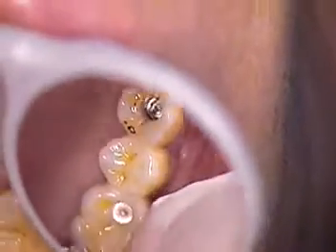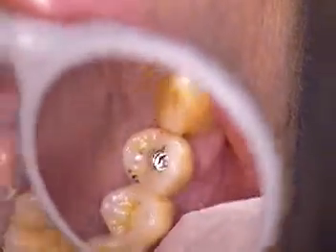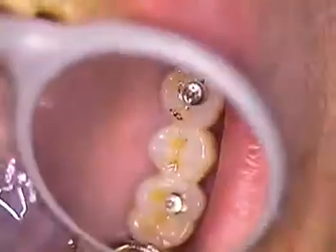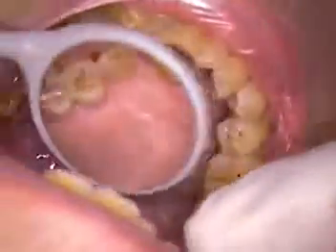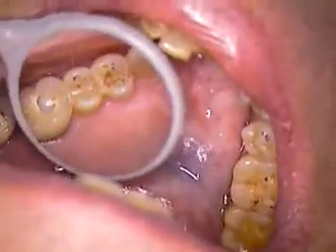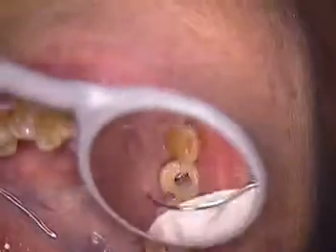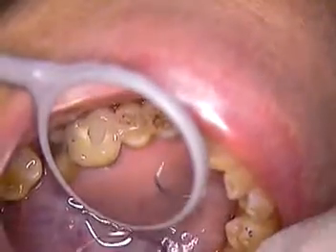Flossing is fine, no problem — snaps through. We use GlideFloss. Contours are exactly what we wanted. We can look at cloning teeth today through the software. I basically wanted the same similar dimensions as these bicuspids on the left side, which she did properly. Molar, again, staying a little bit larger than the bicuspid, but not as large as the molar back there, giving her a nice small occlusal table in which to chew.